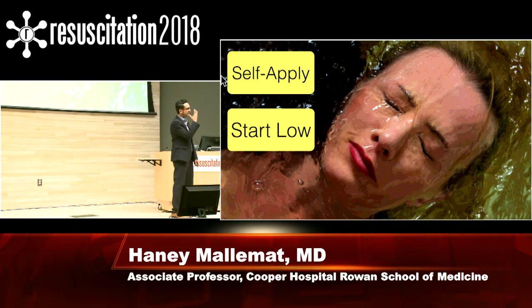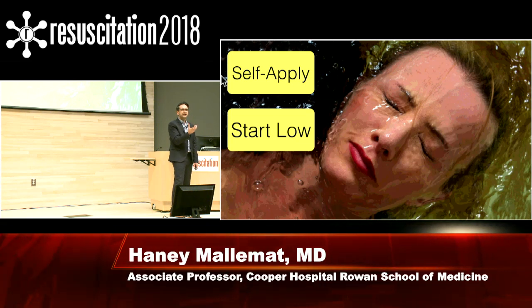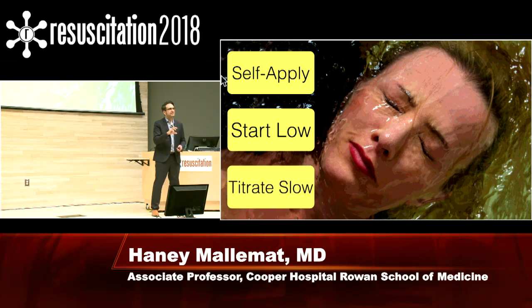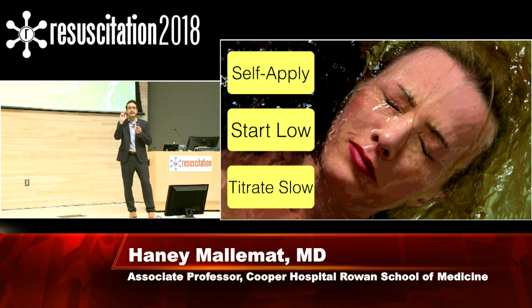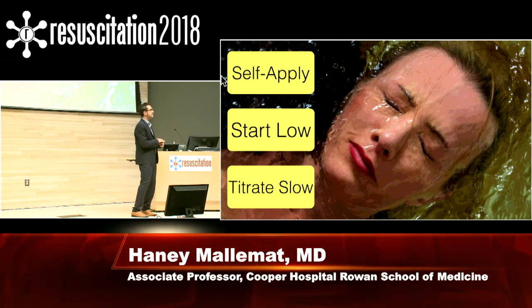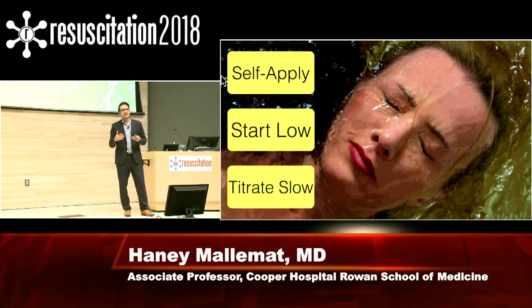And sometimes I'll coach them. I'm like, try now. But I don't put the straps on. And I want them to feel empowered and liberated so that they start to get comfortable with the mask. They start to sync with the machine. And then over time, I start increasing the settings, and then I sneak the elastic bands around their head. And I gotta tell you, once I started doing this, most patients are okay with this. I don't have to give them fentanyl or Haldol or any sort of sedatives. But you gotta talk to them.